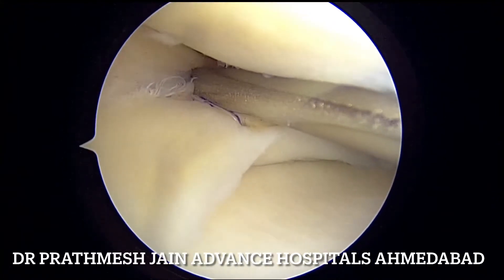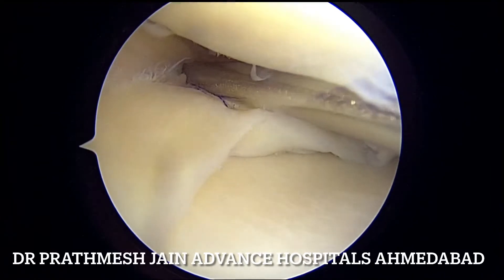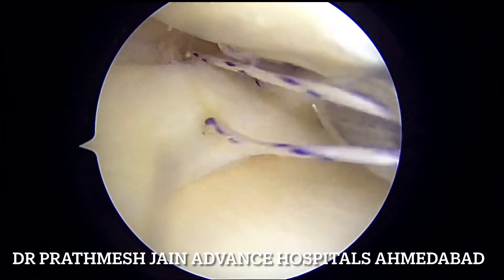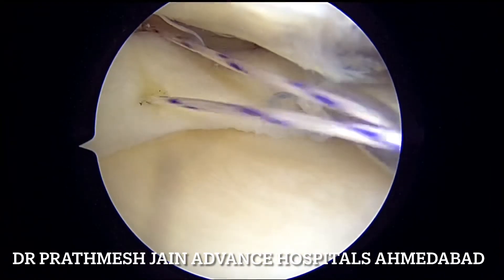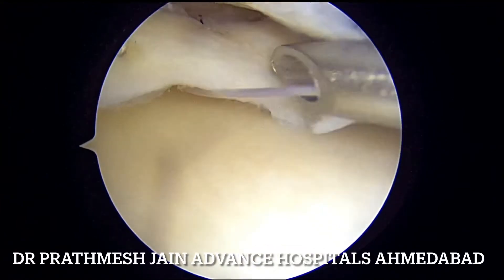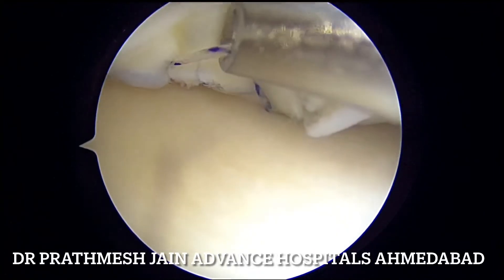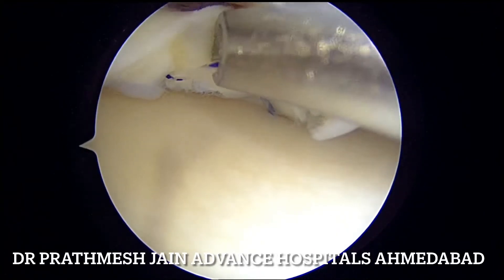These are the two superior components of the bucket handle sutures that we are tying, and then one suture is placed on the inferior aspect as well. This will take care of all the components of the displacement of this tear.